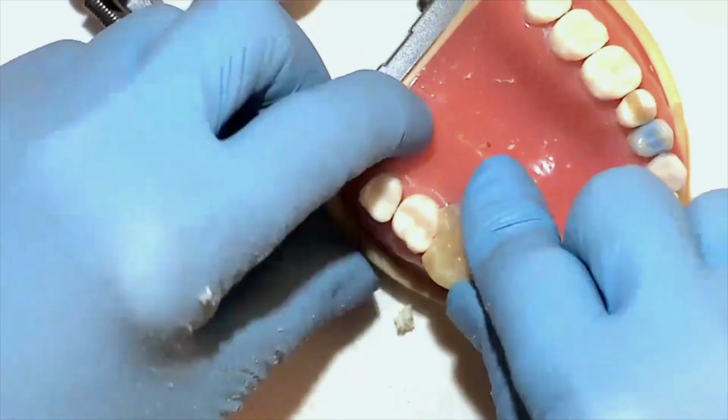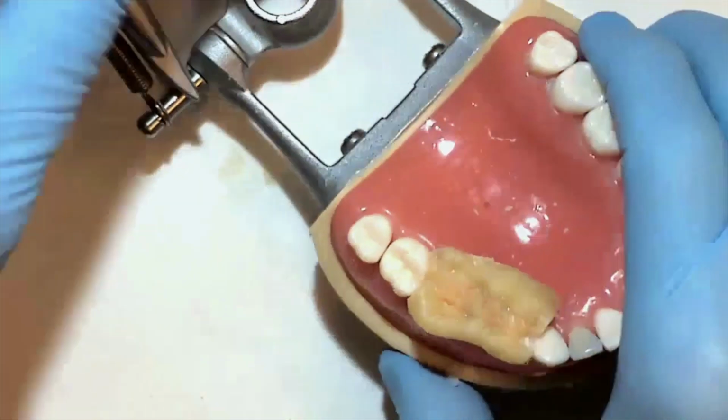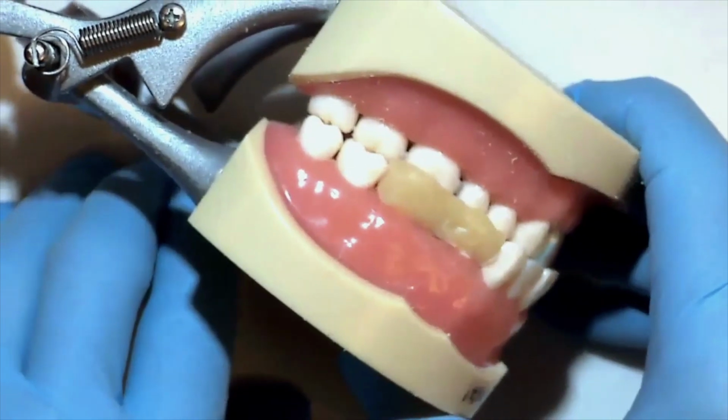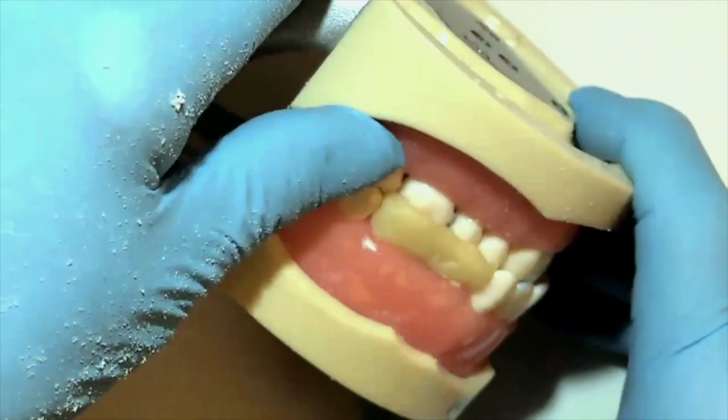It's a good idea at this point to replace the carving back on the articulator. Close the articulator, check and make sure the adjacent teeth are still in contact so we know we haven't changed the bite any. You can see we've accomplished that here.